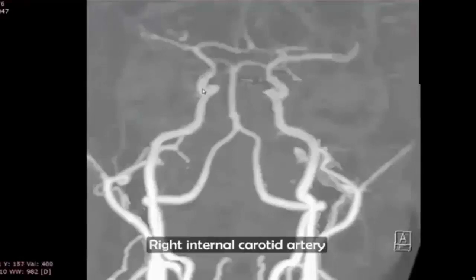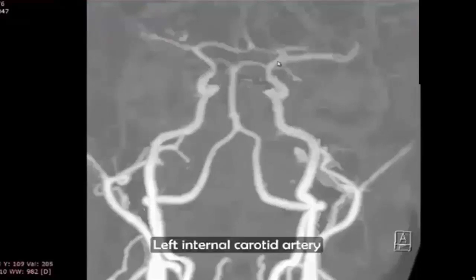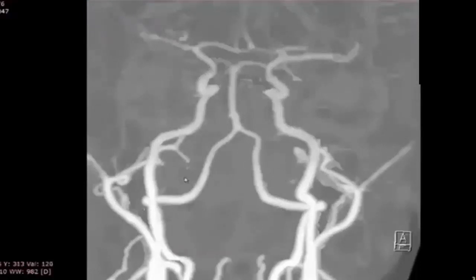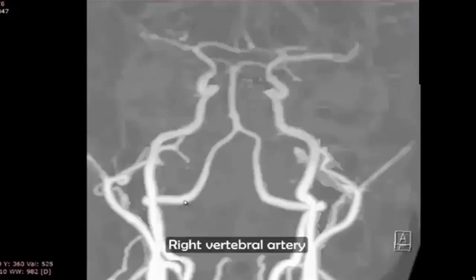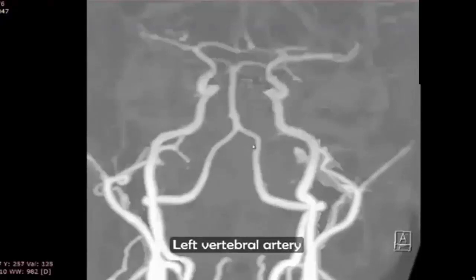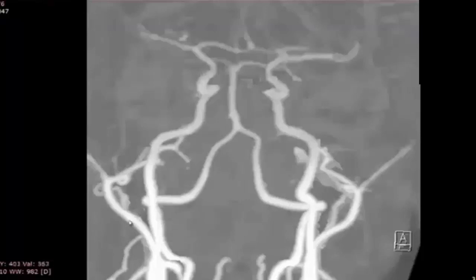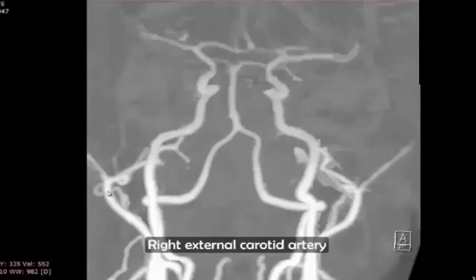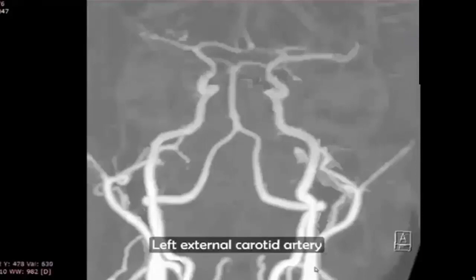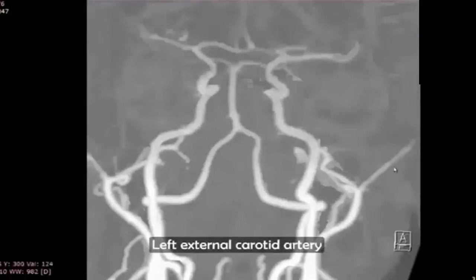Right internal carotid artery, left internal carotid artery, right vertebral artery, left vertebral artery, right external carotid artery, left external carotid artery.